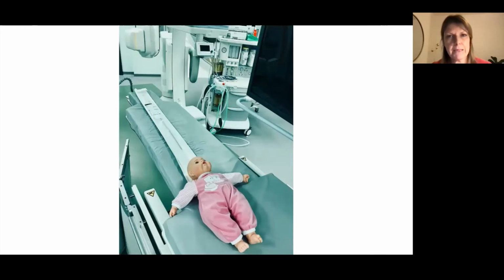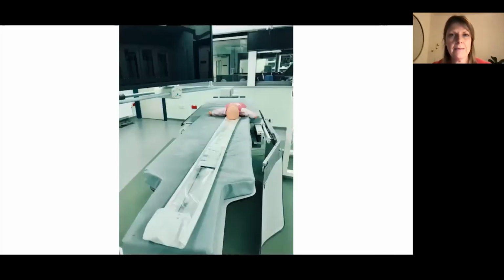So this delivery device in the package here on the bed, you can see, is a biodegradable tracheal stent. It's 7 or 8 millimeters in length. And this is what it looks like from the other end when you're about to deploy it. So this is the size of the delivery device. And on the end of this is that tiny stent that you've got to place in exactly the right position in the distal trachea, just above the carina, not into the left main bronchus. And that is a pretty big delivery device in which to be doing that.